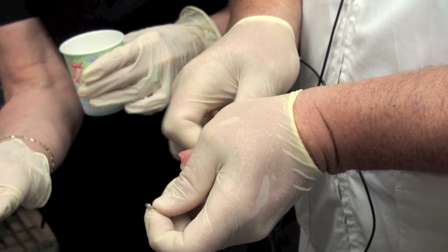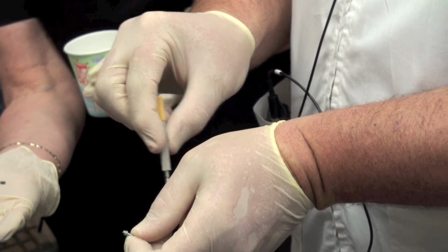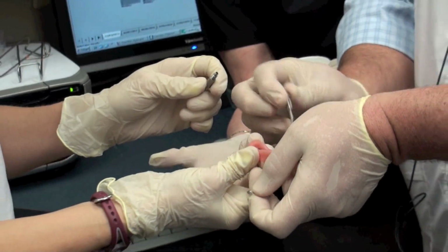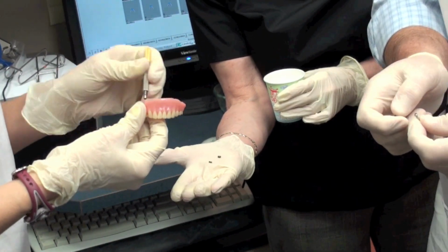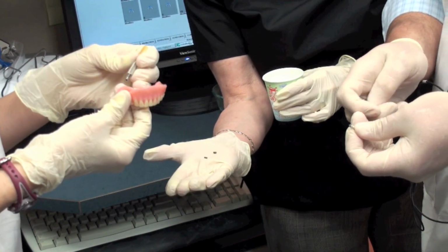So when you put this back in, you have to kind of hold it so gravity will help you. So you turn it upside down and let gravity help you, and then you kind of push it in. You just push it in, and you hear the snap. Oh, that's so neat.